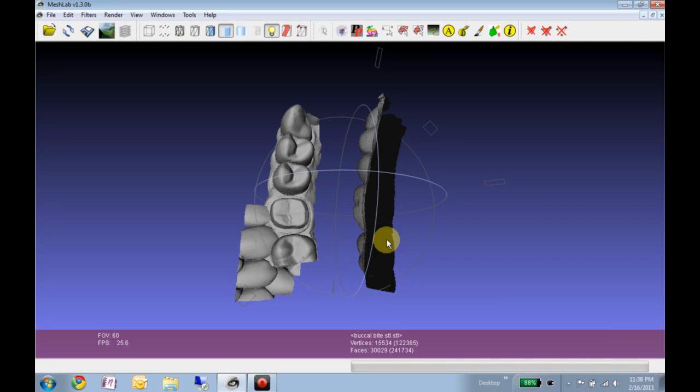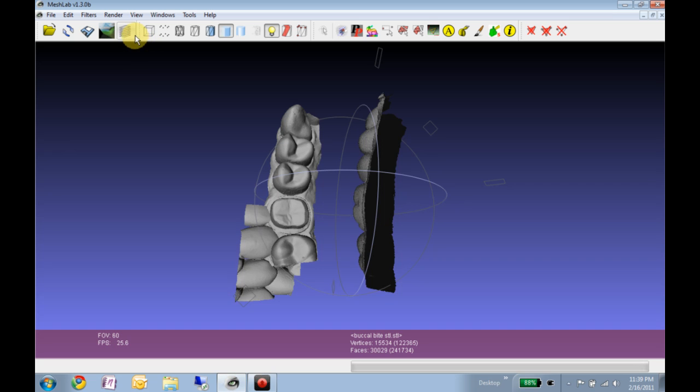Okay, I wanted to show a demo of registering two models together using a buccal bite scan or any kind of registration scan. It could be a facial of the anteriors or anything, but I just wanted to demonstrate the principle.